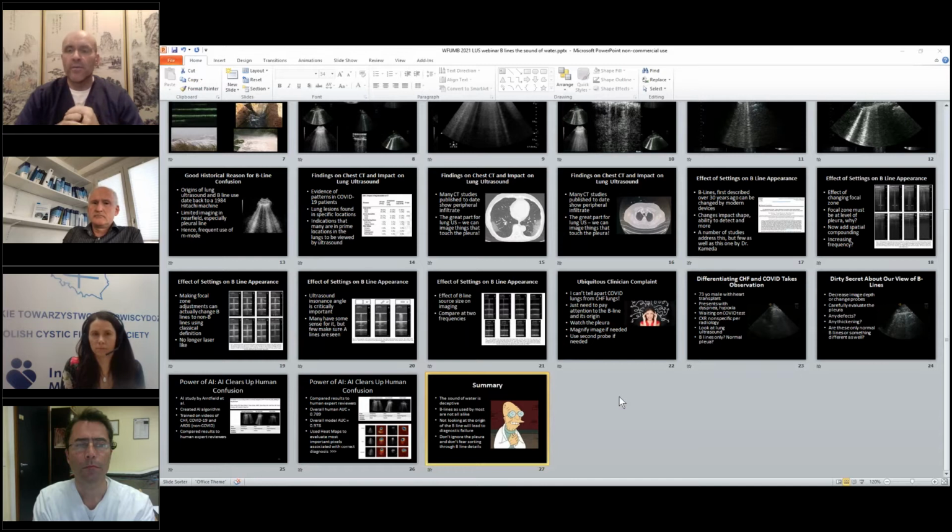I'll be honest, if the time pressure is not significant, the examination gets longer the more interesting it is. So the more findings I have, I'm always recording, changing image magnification, maybe adding on color Doppler, maybe switching probes, and then it gets much longer. But for me, I typically have about 5 to 10 minutes at most for an exam.